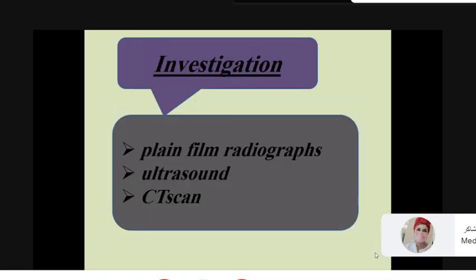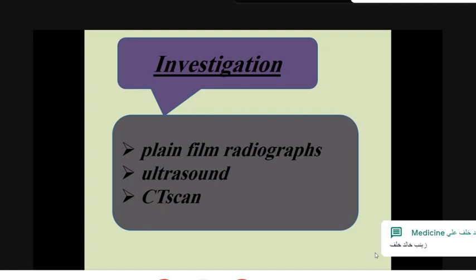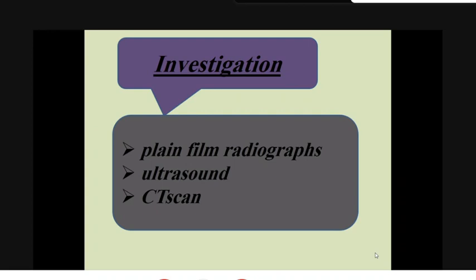You know that the chest X-ray is used for assessment of the lungs and the mediastinum. It can be used for assessment of the acute abdomen, particularly in pneumoperitoneum, because both diaphragm and the upper abdomen should be present within the chest X-ray. So it is superior to the erect plain abdomen for diagnosis of pneumoperitoneum.